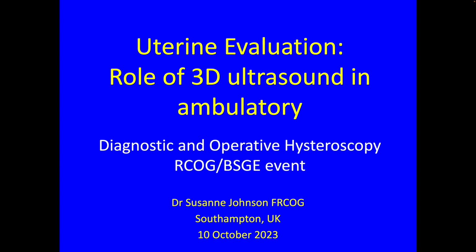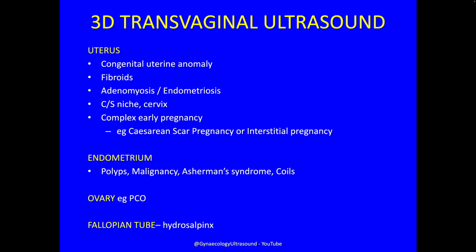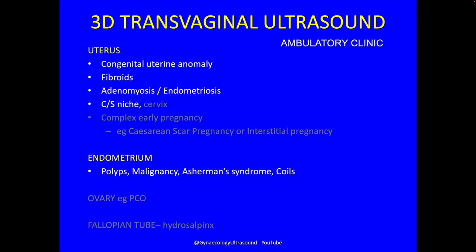Thank you for asking me to talk about the role of 3D ultrasound in an ambulatory setting. 3D transvaginal ultrasound is extremely useful in all these different scenarios. In the setting of an ambulatory clinic, I'm going to focus on discussing these different indications for 3D ultrasound.